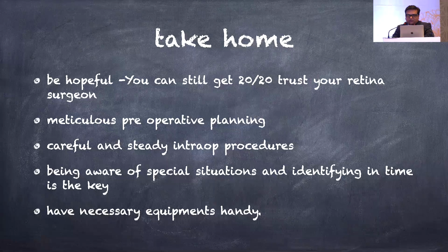Meticulous intraoperative, post-operative, and pre-operative planning is very, very important. Have the necessary equipment ready, because these are not simple phaco cases. So all the equipment you need, forceps, scissors, everything should be ready when you take up these cases.